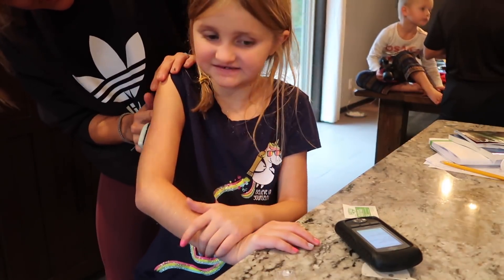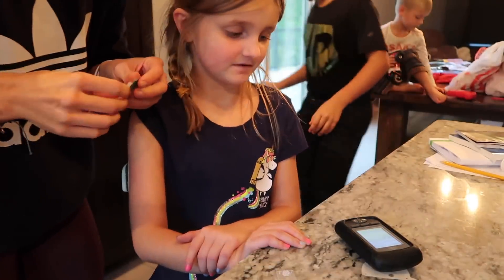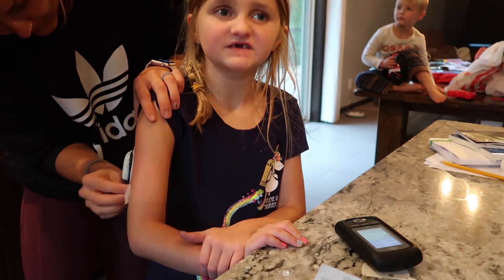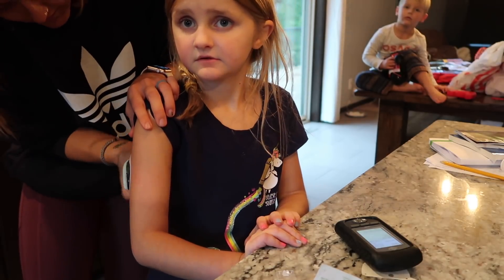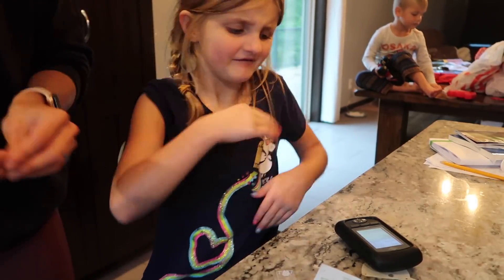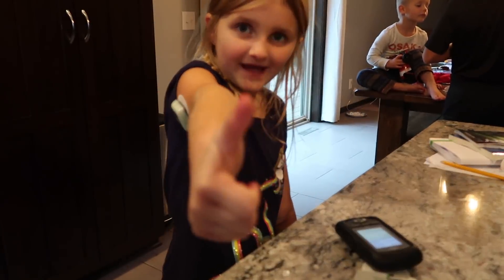It itches. It's sticky? We're done. Mom, can you... Daddy, can you get the three-fourths cup out? Cause I'm having Lucky Charms. You already dosed yourself for Lucky Charms? Uh-huh. Three-fourths cup. Bye, guys. Show your arm. Awesome. Bye, guys.